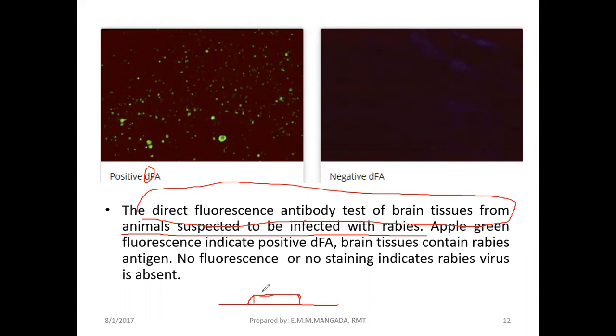So guys, here in this tissue, we have this rabies antigen. Let's say that's the shape. Okay? So this is the rabies antigen, or these are the rabies antigens. That's their shape. And then we use antibody. Again, the name of our antigen is rabies antigen. They are the triangles.